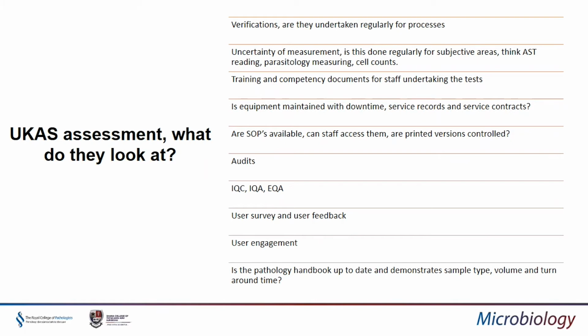So we write up the uncertainty of measurement, and this is signed off by, for Swansea, myself, the operations manager and the clinical lead as well, to ensure that the uncertainty of measurement is low, and works out the risk of that on patient samples. So we need to undertake these regularly for all subjective areas. Another area could be things like doing cell counts and parasitology measurements as well.